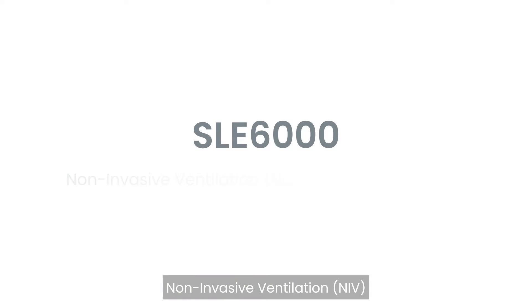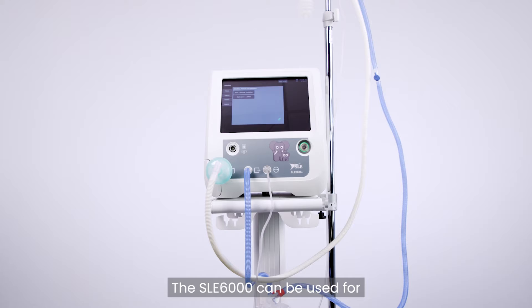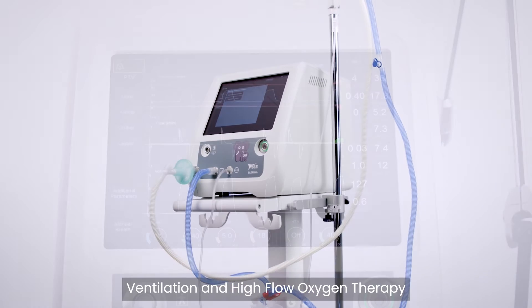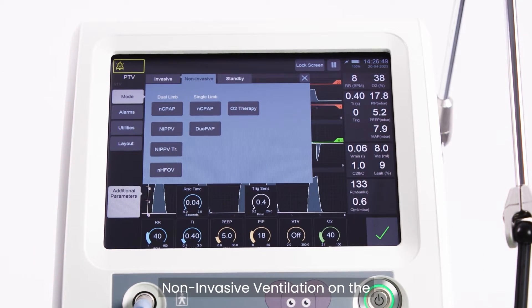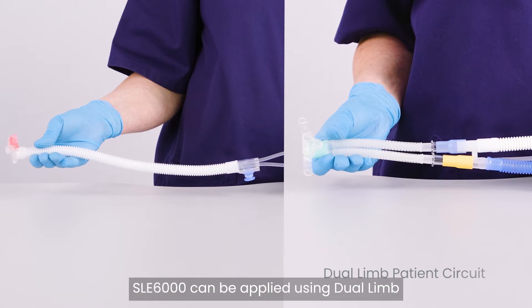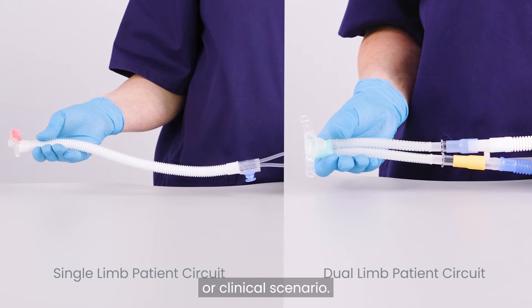Non-invasive ventilation connections on the SLE-6000 using Fischer and Paycal F&P circuit. The SLE-6000 can be used for non-invasive ventilation and high-flow oxygen therapy if these modules are installed on the ventilator. Non-invasive ventilation on the SLE-6000 can be applied using dual-limb or single-limb patient circuit configurations, depending on the user's preference or clinical scenario.